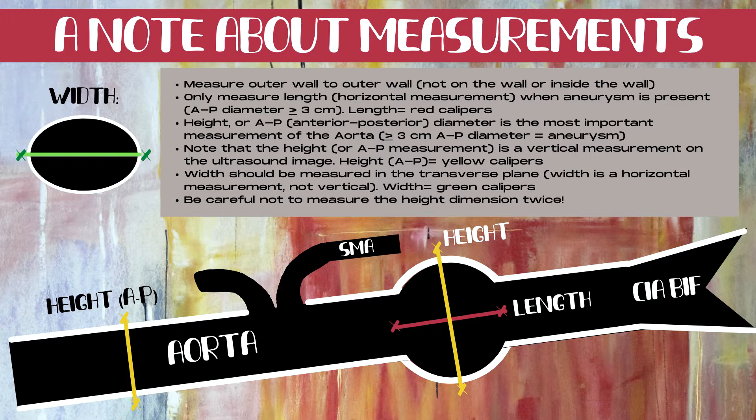The height, or AP — the anterior-posterior diameter — is the most important measurement of the aorta. Greater than or equal to three centimeters AP diameter is considered an aneurysm. Note that the height or AP measurement is a vertical measurement on the ultrasound image, and the height or AP dimension is represented by the yellow calipers on this image.